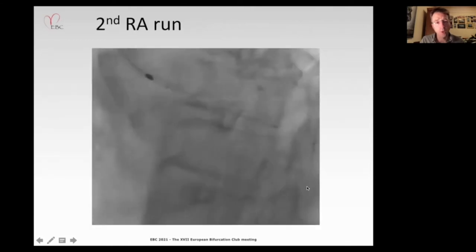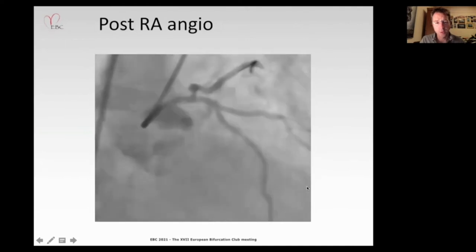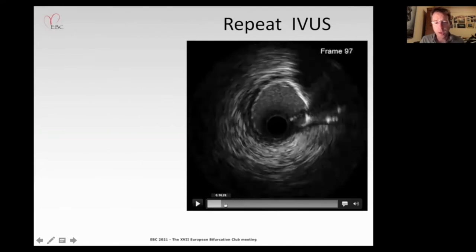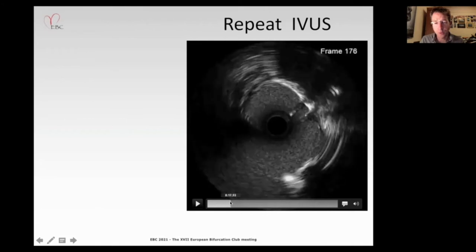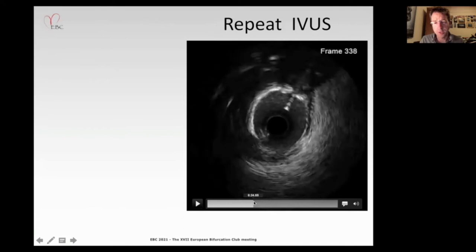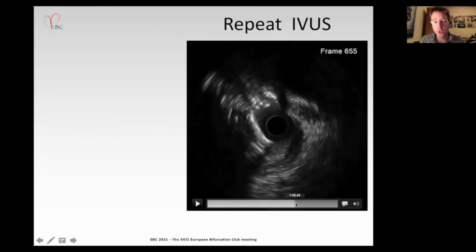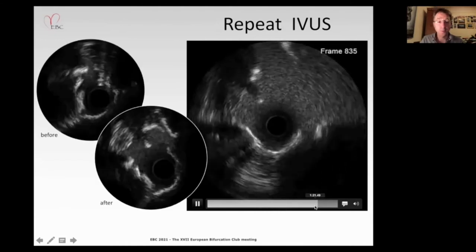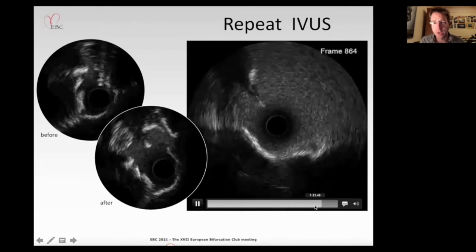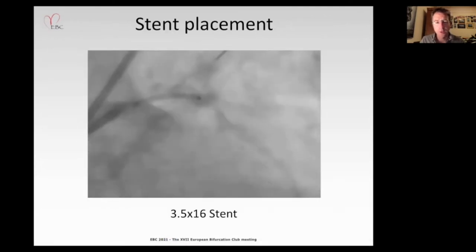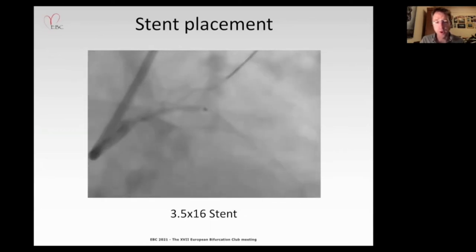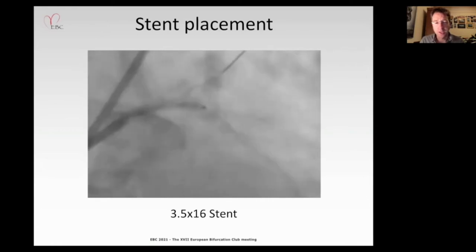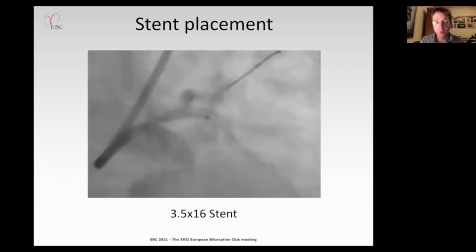My interpretation: with the protrusive and high-burden nature of the calcium, rotational atherectomy is necessary to achieve effective expansion of a stenting device. By IVUS, we can confirm the position of the interventional guidewire, which is in contact with the roof of the left main where the burden of calcium is highest. With multiple rotor runs we aim to effectively debulk the lesion. Angiographically there is a slight improvement following that manoeuvre.